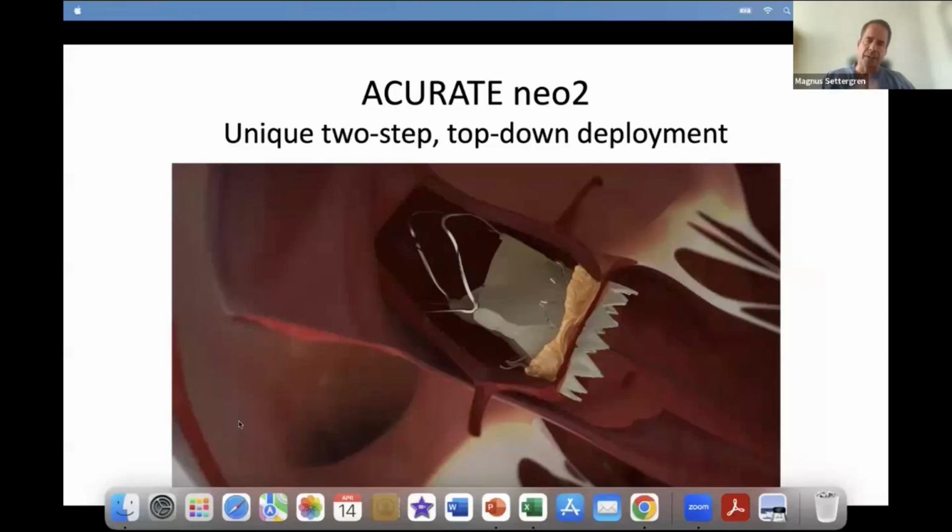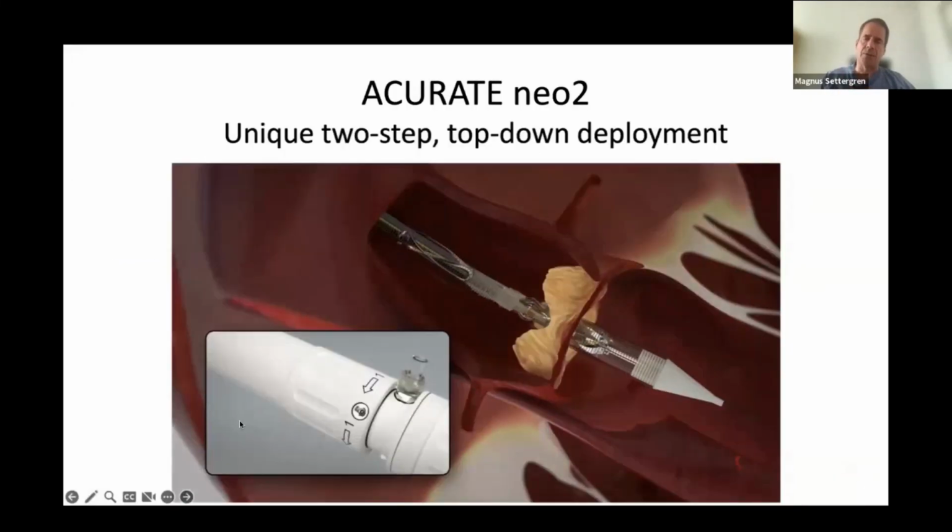Yeah, I completely agree with the way it's deployed. It's in a very standardized way, pretty much like a balloon-expandable valve. And I also just need to point out that this is not a valve that you should try to get into a very, very high position.